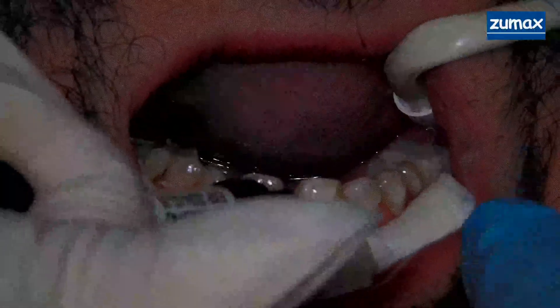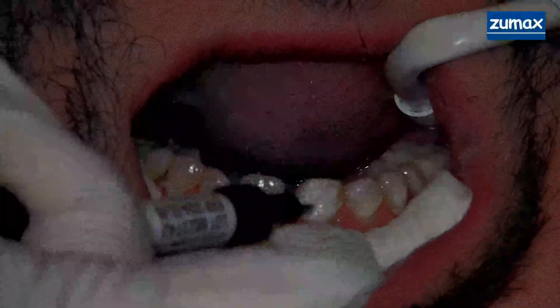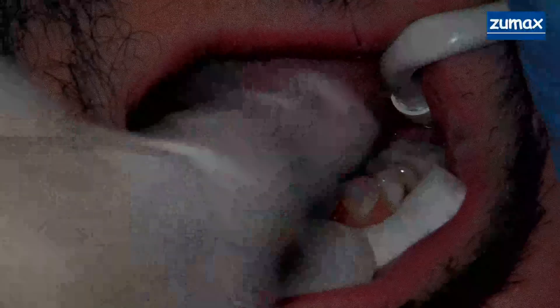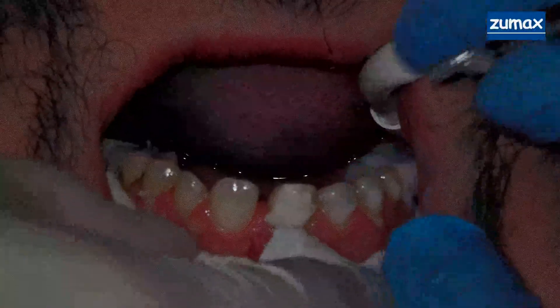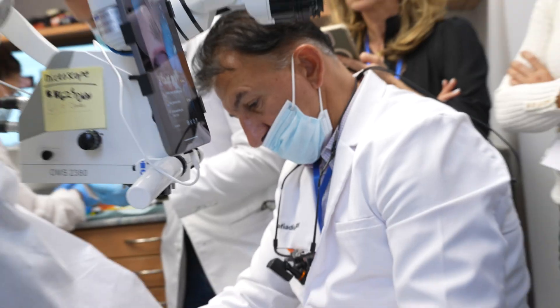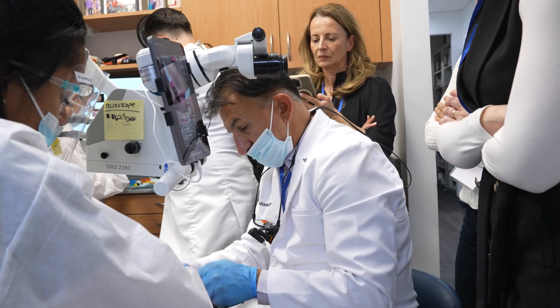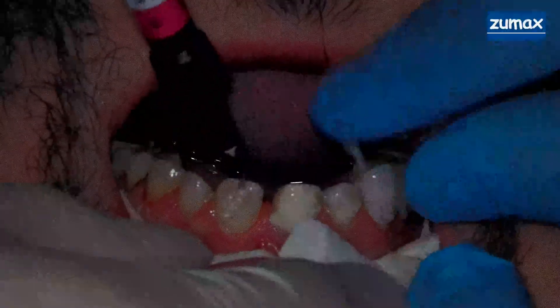Hello, you've got to hurry up. 5. There goes 5. Careful when you transfer, please. Number 8 is in.